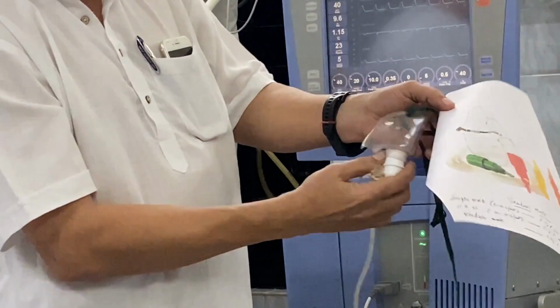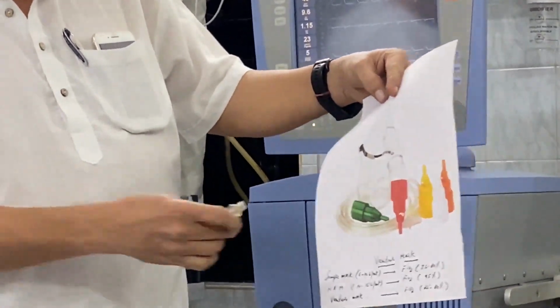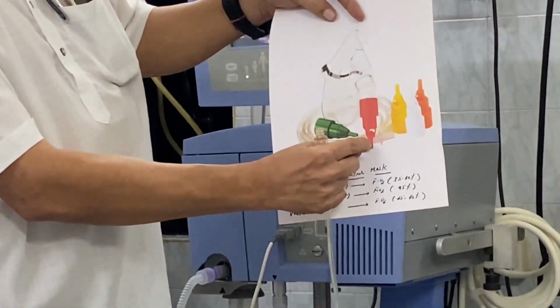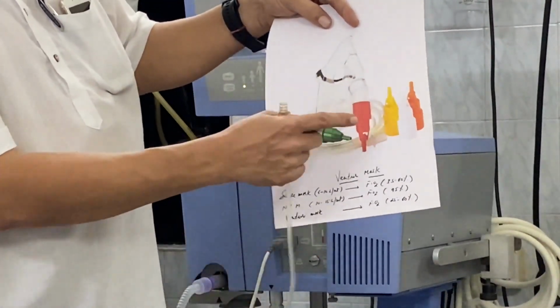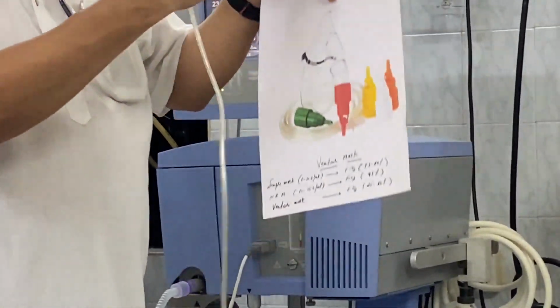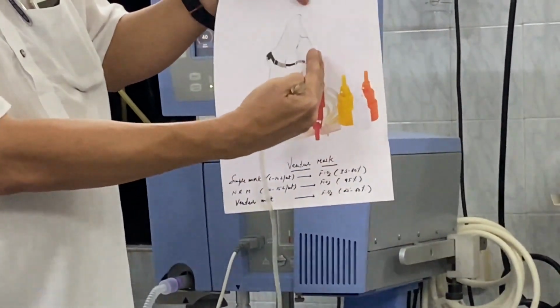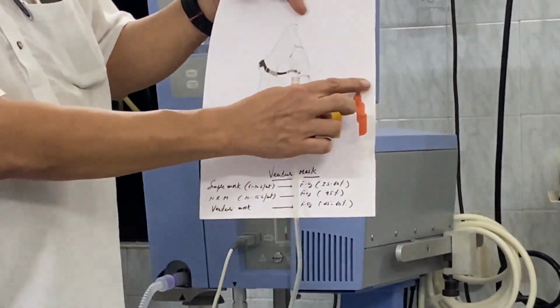to these different types of masks. So what Venturi does is, when there is high flow oxygen going to a narrow caliber, you can change the diameter of these inlets. So it creates a high pressure jet, and there are side holes to this adapter. By physics principles, it sucks in the air, or entrains the room air along with the high flow oxygen. So the amount of entrainment will depend on the size of the nozzle.